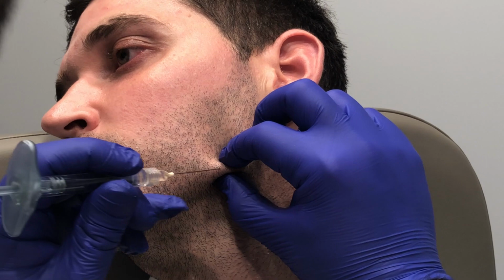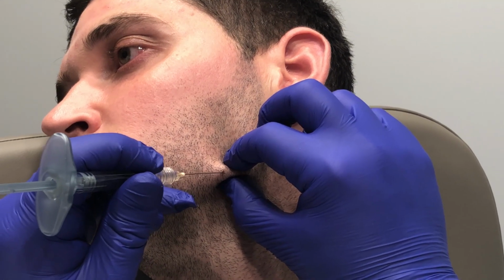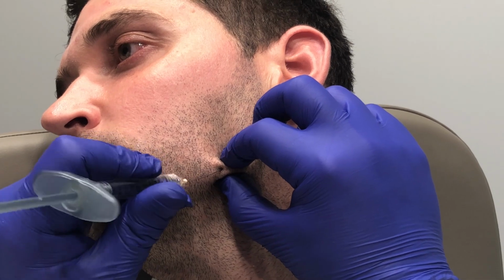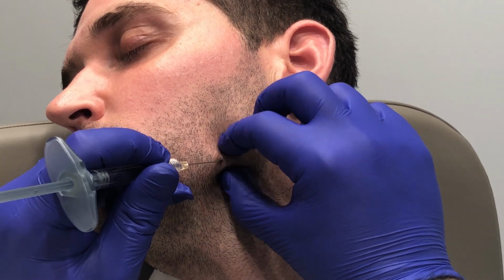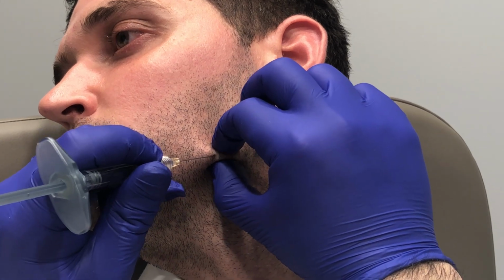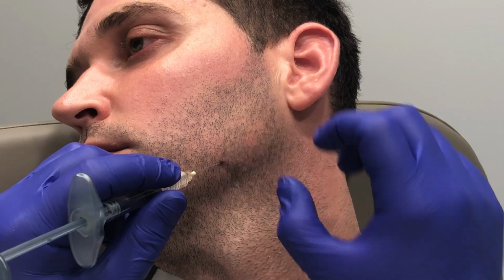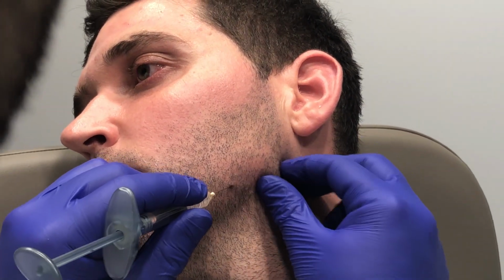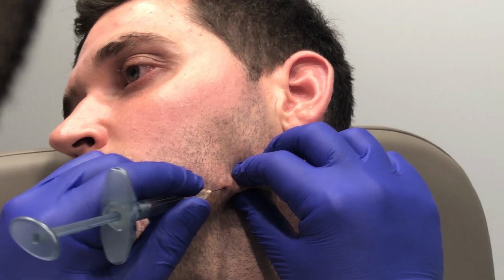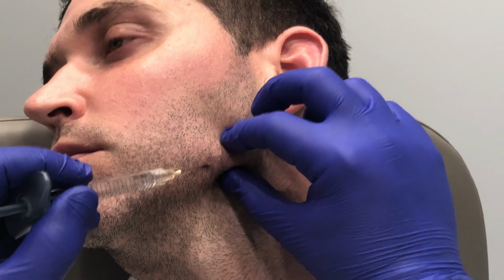And we can see a tiny little drop of blood. That's where we know where our little hole was. And now we're going to just thread the needle, so to speak, and just work on getting right into that tissue. Okay, just like that. And we're going to go right down onto what we call the mandible, or the jawbone. You can feel us working right through. Very little resistance at this point.